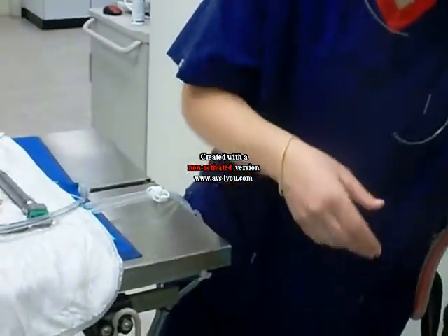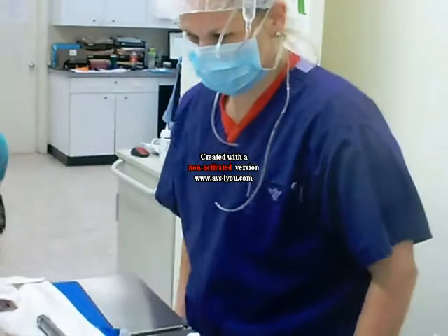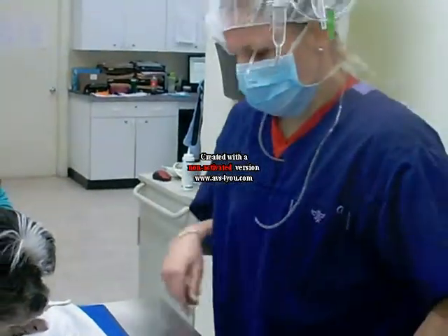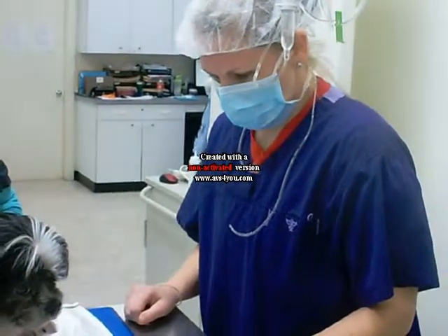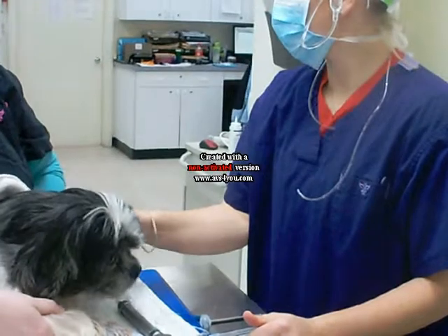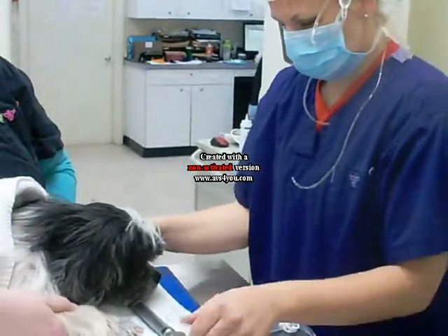once he is out enough, I am going to use a 6.5 ET tube, and then he will be hooked up to isoflurane.